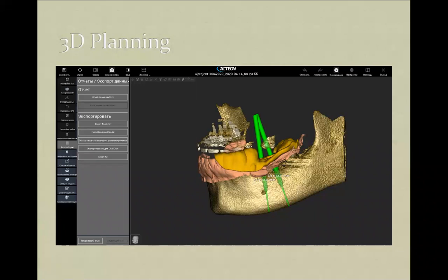So we can do that quite frequently, every 2 or 3 months, and the exposure is very limited. If you need only the mandible, you can focalize the CT scanner on the mandible only, and the radiation exposure will be very limited. And nowadays, these CT scanners are also provided with virtual planning software.